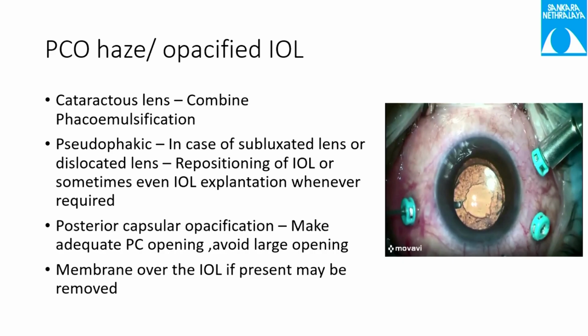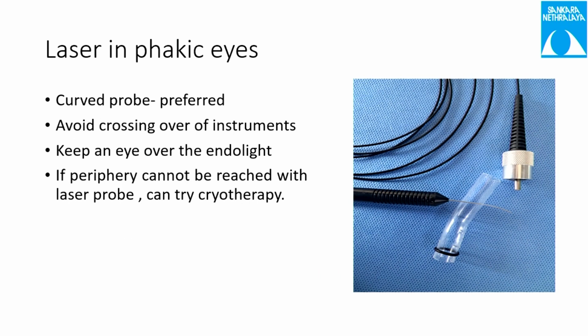Try not to make a large PC opening. It's very dangerous because one might end up dropping the IOL and complicating the surgery. And at least 3 millimeters of pupillary opening is more than sufficient for a better visualization of the vitreous cavity.